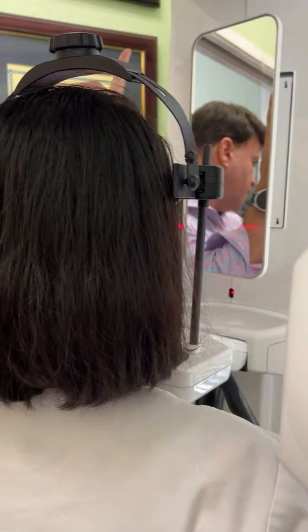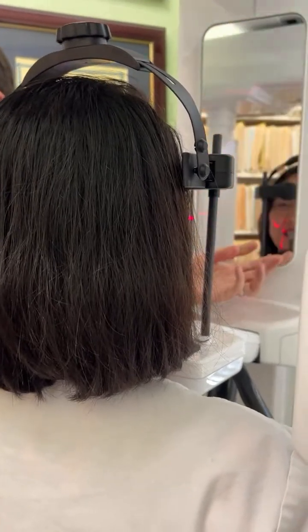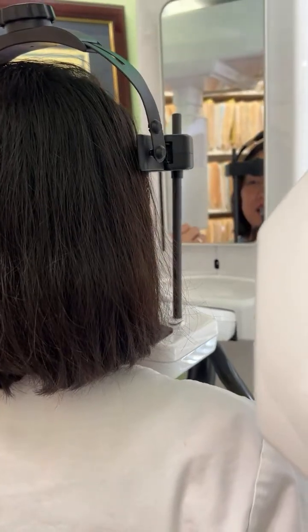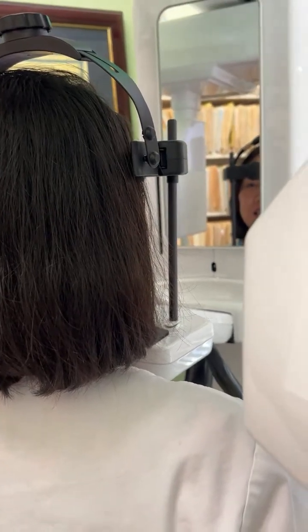If this is left open, the green light will stay off and it will not work. It'll tell you over there, mirror's open. Now it's closed. When it's open, it will not be ready for work. All right, the laser lights went off, on again.